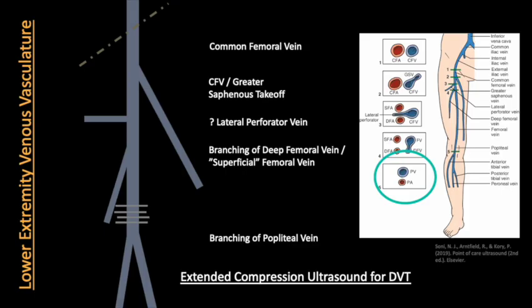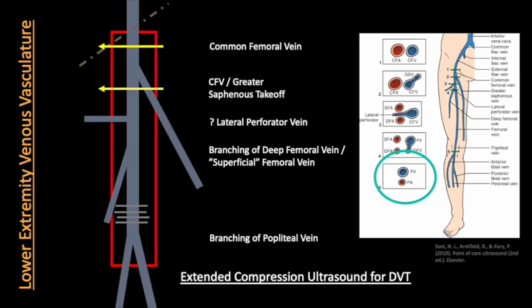The extended compression ultrasound protocol involves compressing the deep venous tree from the inguinal crease to the popliteal fossa every couple of centimeters, and capturing images of any areas of non-compressibility as well as key locations. We should capture images at the common femoral vein, the takeoff of the greater saphenous vein, the level of the lateral perforator vein if visualized, the joining of the deep femoral vein and the femoral vein, and the confluence of the popliteal vein. These areas are the most commonly implicated in DVT formation and represent the minimum documentation requirements to show with high likelihood that there is not a DVT present.